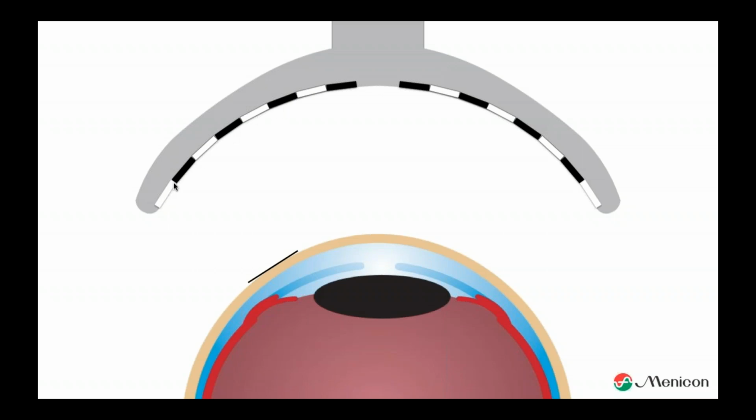So everything is angled, and the only thing the topographer is doing is looking for its tangent point. So okay, I have this angle. Which angle is it on the eye? If we put it on, the light bulb will hit the measuring device in the center. The only thing a topographer is doing is measuring, okay, what is my tangent point?